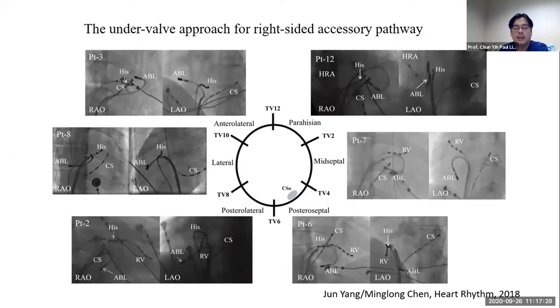However, stability also is slightly more of a problem as compared to the retrograde aortic approach, where stability is a bit better, especially in the transeptal approach where it's an anterior lateral pathway. Sometimes stability may be a concern. So sometimes I overcome that by using a contact force catheter. So far, I haven't really had a real necessity to use a deflectable sheath. But of course, that will be on the table if I can't get good contact.